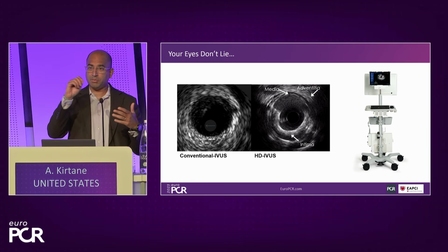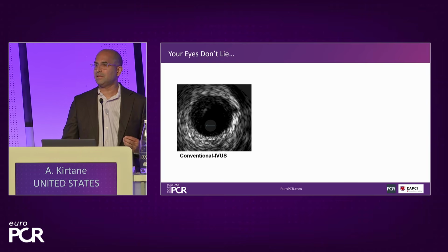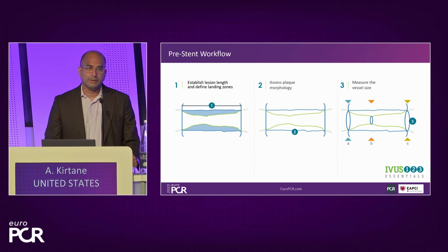You can actually watch people making measurements because there's screens on both sides. And the bottom line here is that you're right, that your eyes don't lie. When you were only looking at this, it was not easy to do. But now that you're looking at this, it's certainly worth a chance looking again to see if you can implement these in your clinical practice. Now, what do?